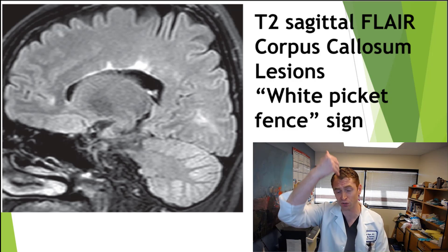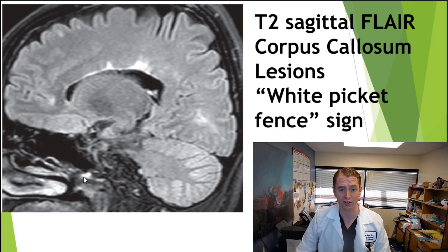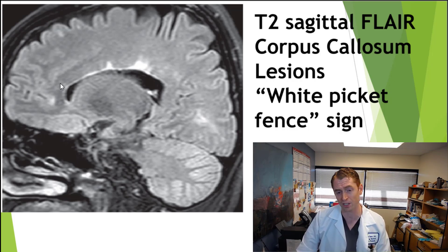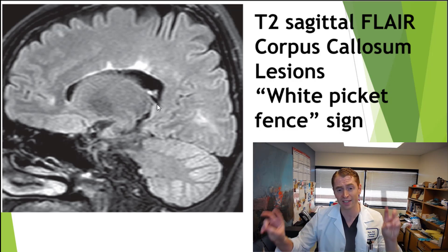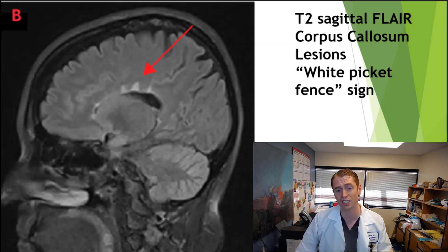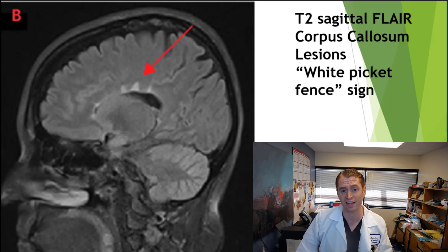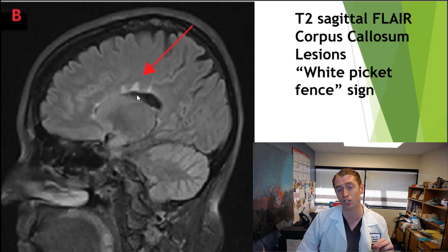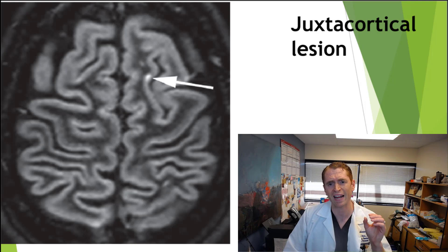Here you're looking at sagittal images through the center of the brain, where you can see the nasal cavities and cerebellum. This structure is the corpus callosum that connects the two cerebral hemispheres. You can see white lesions like stripes lining up — this is sometimes called a white picket fence sign. Here's another example of lesions in the corpus callosum that are highly typical of MS. You can see similar lesions in another disease called Susac's disease, though they usually have a smaller, rounder snowball-like appearance.